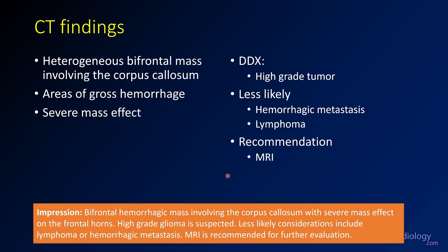When dictating your impression, call this a bifrontal hemorrhagic mass involving the frontal lobes and corpus callosum, with bad mass effect on the frontal horns. Suspect a high-grade glioma; less likely considerations are lymphoma and metastasis. Recommend an MRI. That's really the key information you want to convey on your CT.